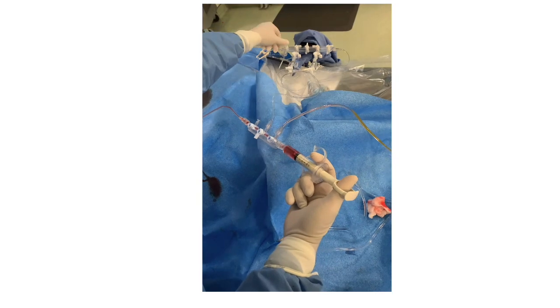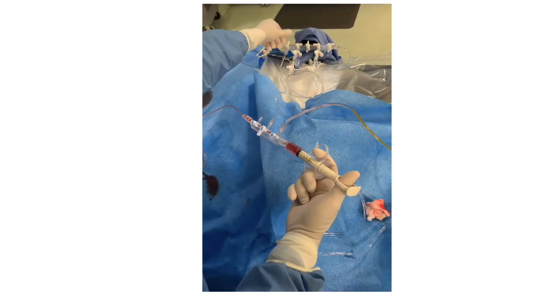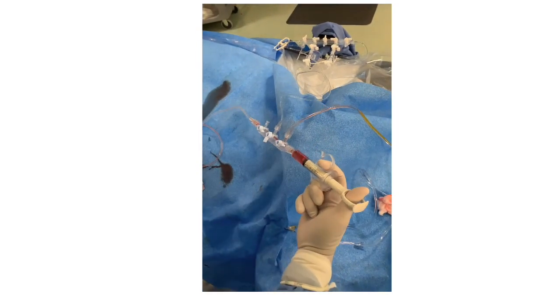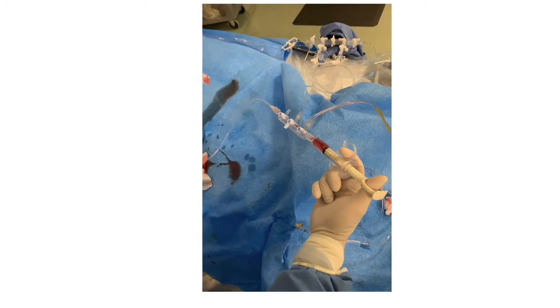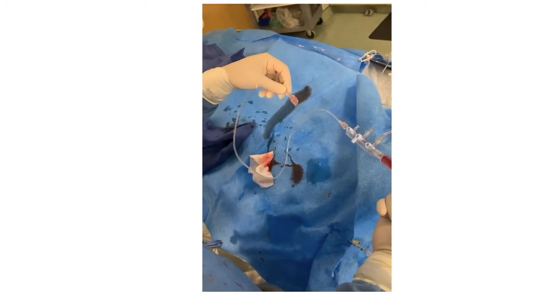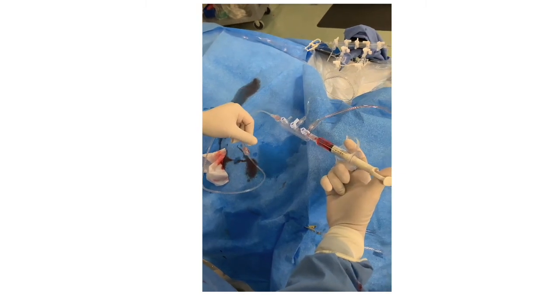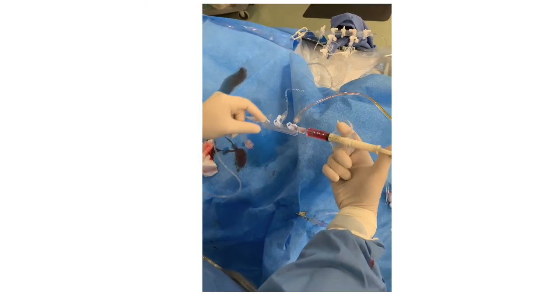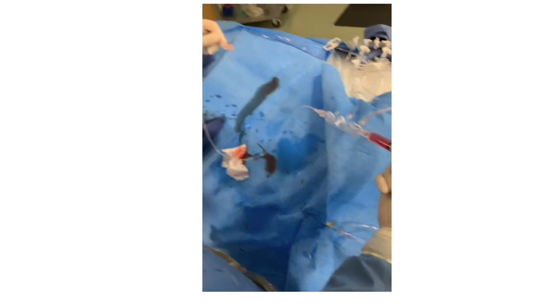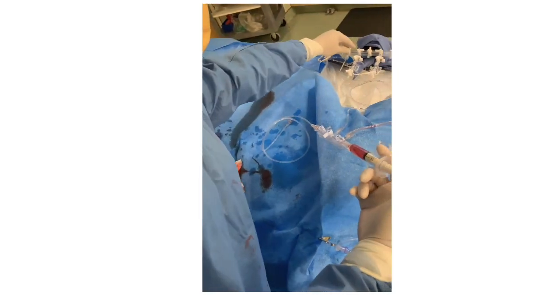This is back to zero position, back to pressure, saline on. And we're now directing the saline through the manifold that's dripping out the front as you see here. If we turn the middle valve away, this will allow the saline to pressure back into the chamber. Here it is going forward again.